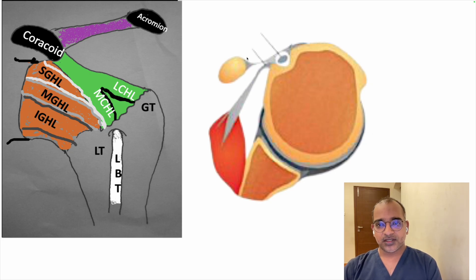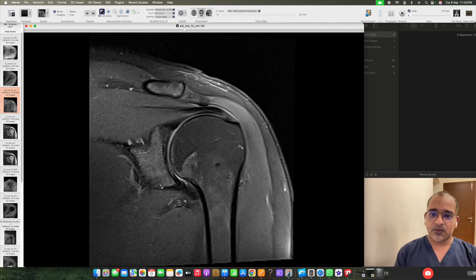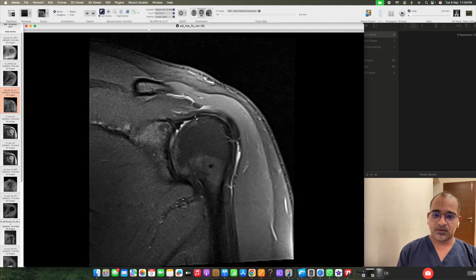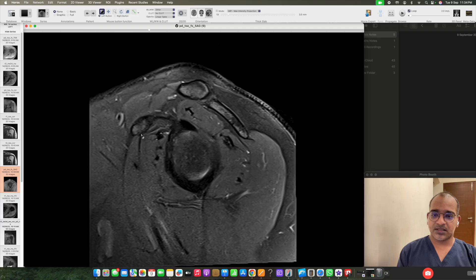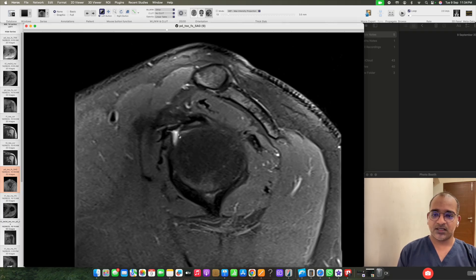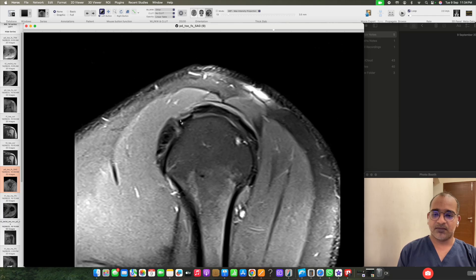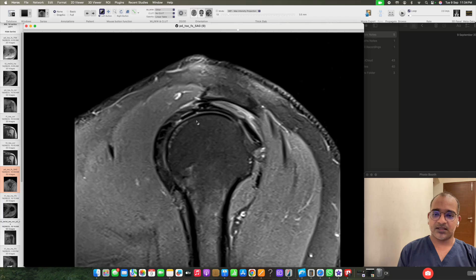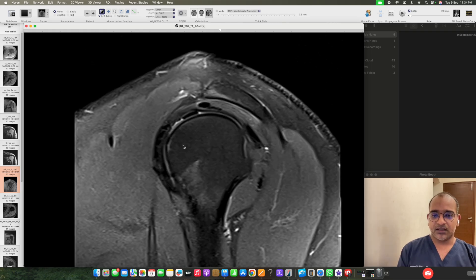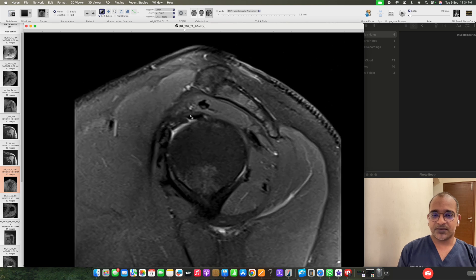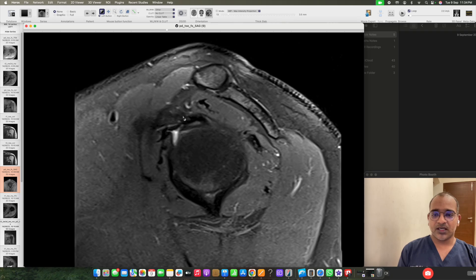This is the gross anatomy. On MRI images, here we can see the supraspinatus tendon and the long head of biceps tendon. On the sagittal PD fat-sat images, we can see the biceps anchor, the long head of biceps tendon, and the rotator interval — which is the space between the supraspinatus tendon and the subscapularis tendon. Here we can also see the long head of biceps tendon and the coracohumeral ligament.